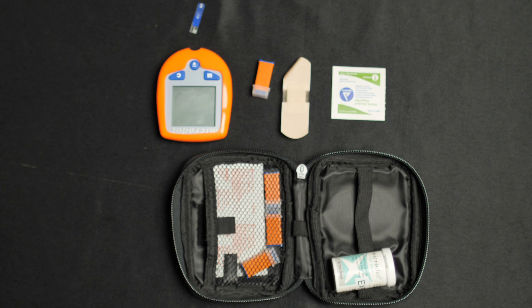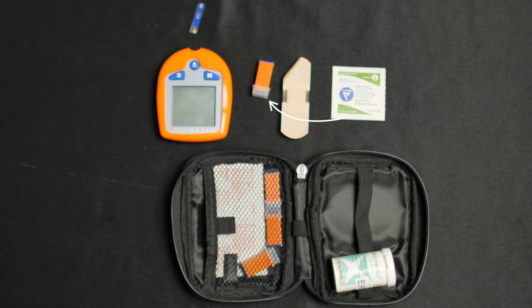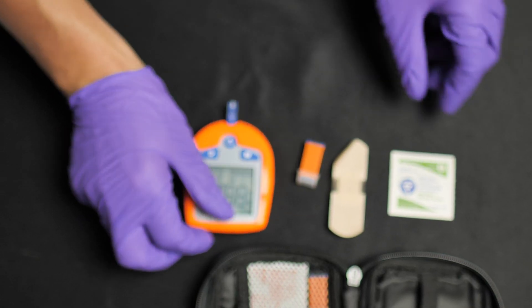When we take a blood sugar, we use a glucometer that usually comes in a little kit with band-aids, alcohol prep pads, a lancet to pierce the skin, and test strips. I like to insert the test strip into the glucometer first, which allows it to turn on and warm up — sometimes taking several seconds. Don't insert it too early though, because if it sits too long it'll go back to sleep and you'll have to reinsert the strip to wake it back up.